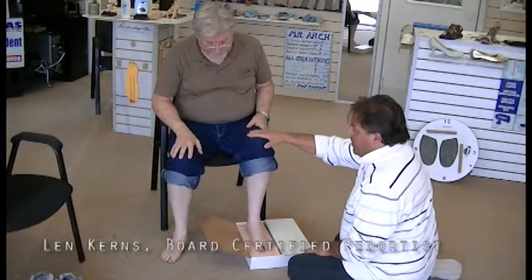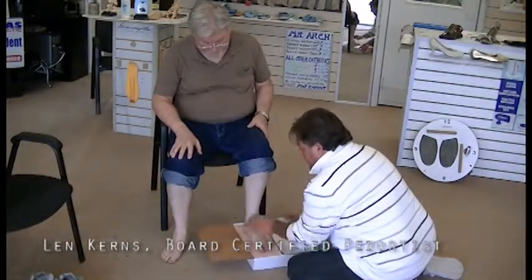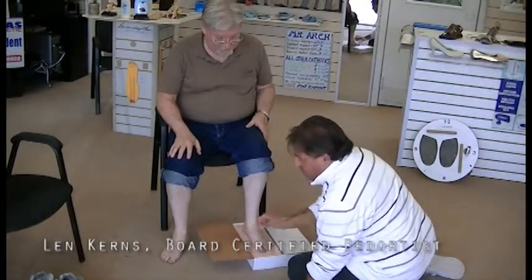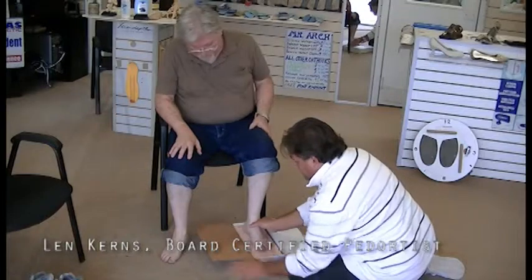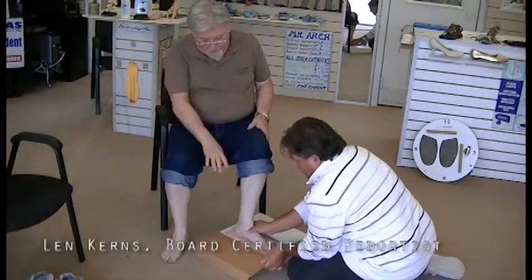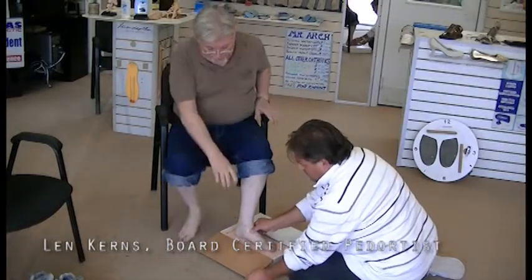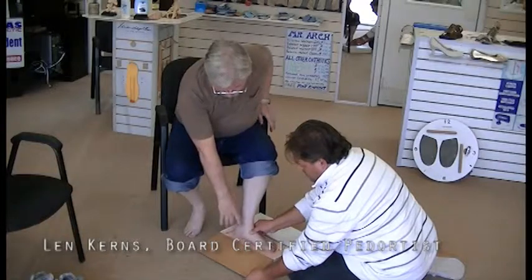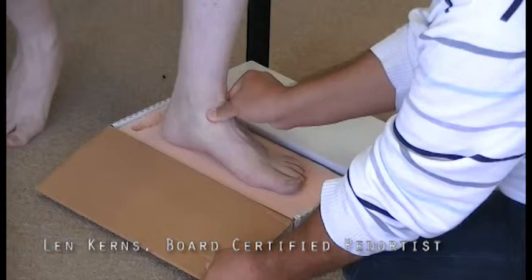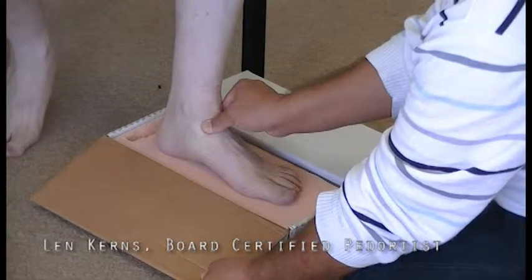I will eventually come up here and guide the foot into position, but right now what we're going to do is hold the navicular bone and talus right in place, and we're going to try and rotate. I'll hold it right there because this is a very important thing for staff. He's putting his thumb right between the inner space of the navicular talus joint. Because as my foot is pronating, the talus is jutting out.